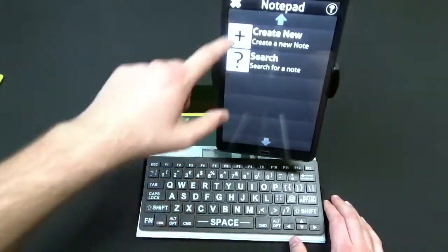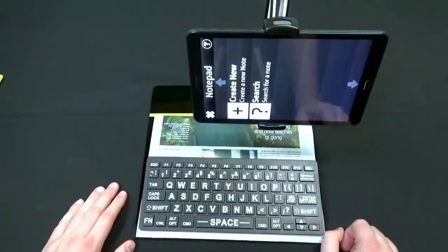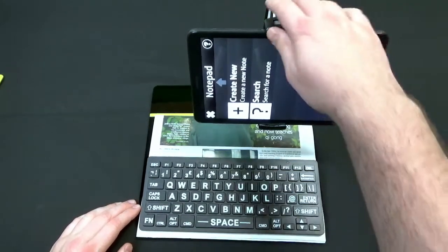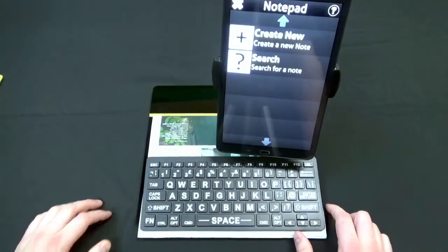Using the stand with the magnifier, you can turn your tablet to do a little bit of distance viewing as well. If you want to look at something across the room — at school or something like that — you can do that. You could also hold it and do that too, but the stand is a nice accessory for distance viewing.